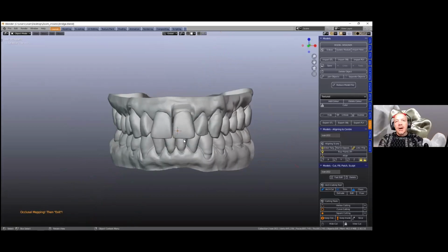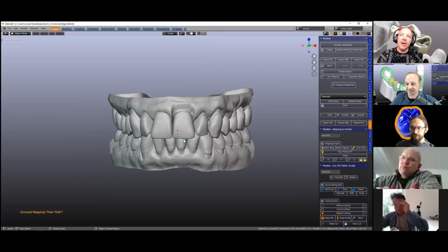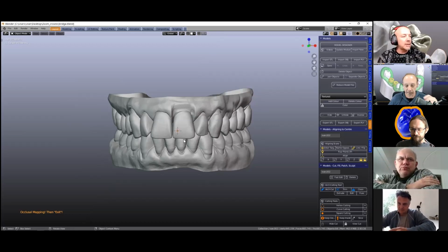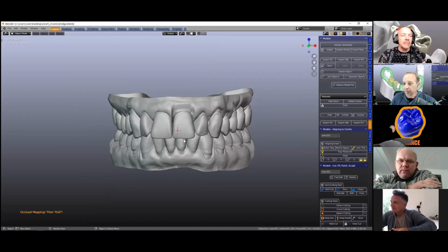All right. So to start off with, it is a bit of a learning curve, as all things are. Once you get to know how it works, then it gets a little bit easier. Our struggle is not only to develop this, but also to teach people how to use it, and the latter is a little bit challenging sometimes, depending on user experience. So look at the video tutorials. They are an education, exactly like when we go to college or university to learn how to make this stuff. This isn't part of an education.